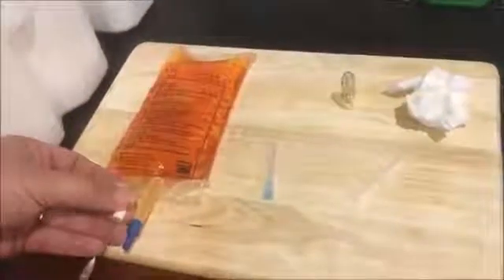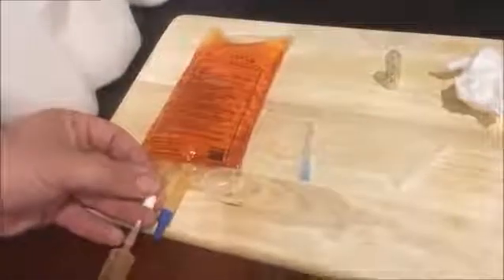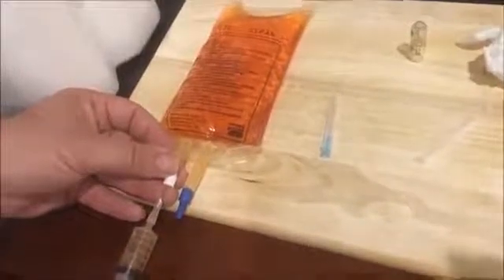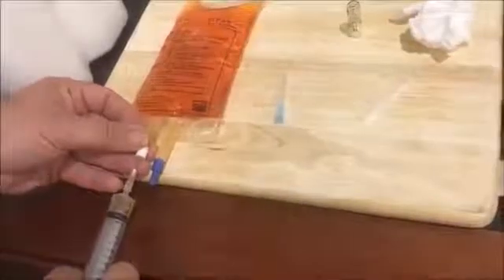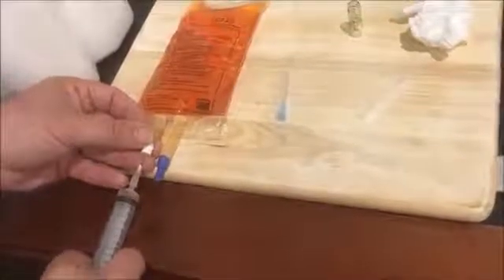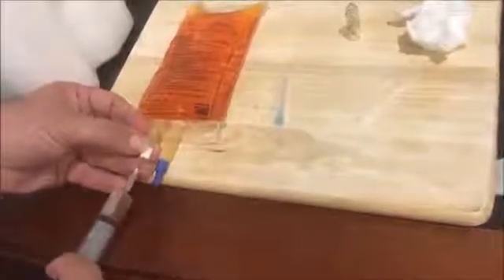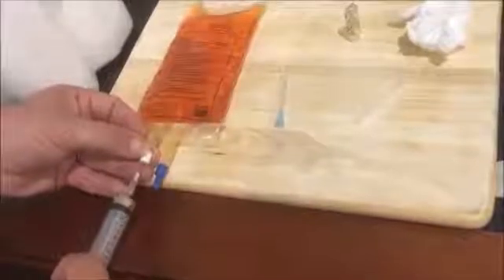Then push the diluent slowly into the bag. You can also draw it back in. The vaccine has now been made up.